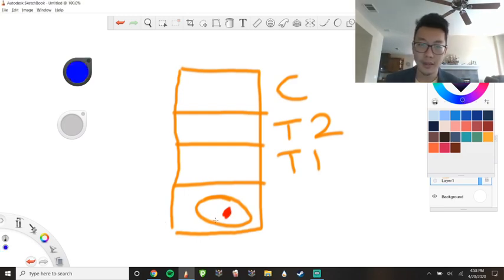And then you add some water. It's actually buffer solution, so it's not contaminated with other things, but it essentially acts like water. So once you add water, there's this action known as capillary action. Because this is a piece of paper, it's going to spread through it. And what capillary action is, I'll get into that way more in a different video, is because essentially water actually has a charge as well.